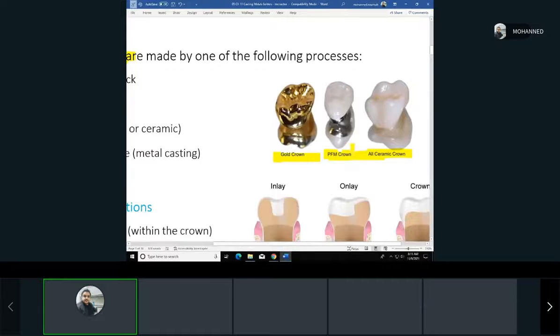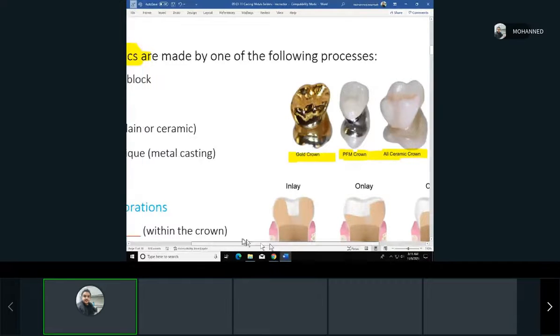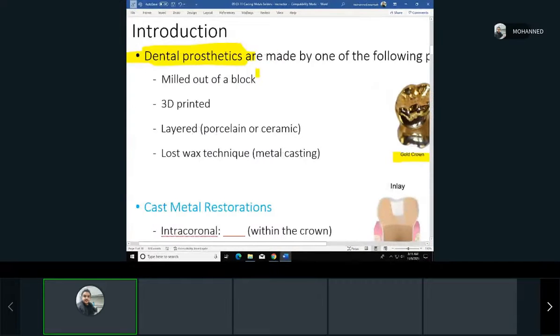So if we want to think about the main methods by which dental prosthodontics are done, they can be milled out of a block. I think I showed you before a video where they mill a tooth. You take a 3D picture of the tooth instead of an impression, or you take an impression, pour a model, and the lab will take a 3D image of the model, and they have a block, and the block will be milled down to make the shape of the crown, right? That is one thing. 3D printing is coming on strong as well.